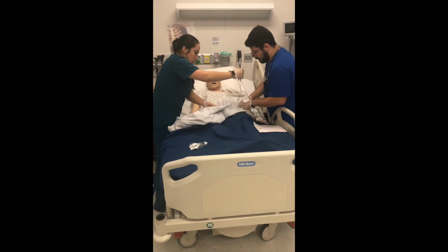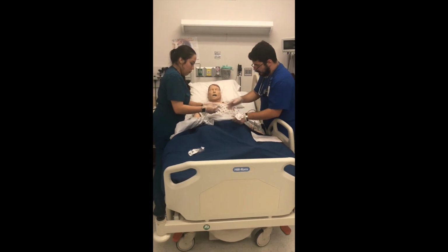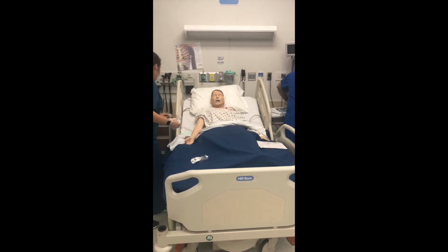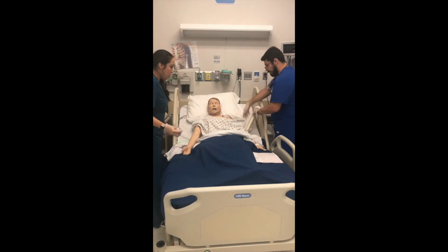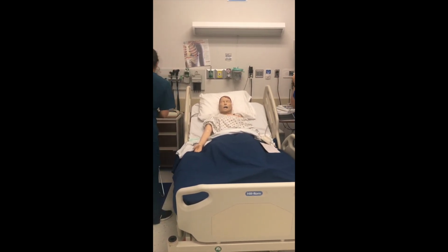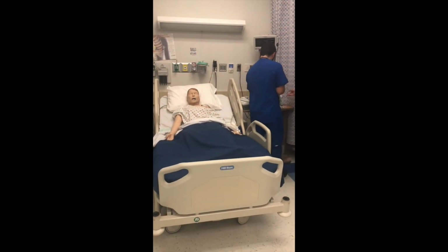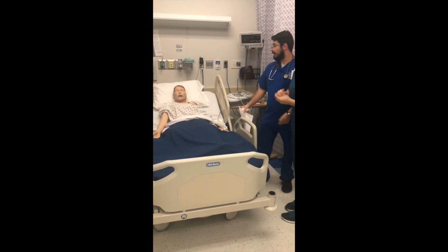Okay, let's get you all covered up here. We're gonna go get the EKG to the doctor, put it in your chart. My doctor will be coming in here shortly to review the results with you. Let's get all this out of the way. Get your bed in lowest position. Make sure you have your call bell here. Warm hand hygiene. And this is all for now. Let us know if you need anything, okay, Ms. Doubtfire?